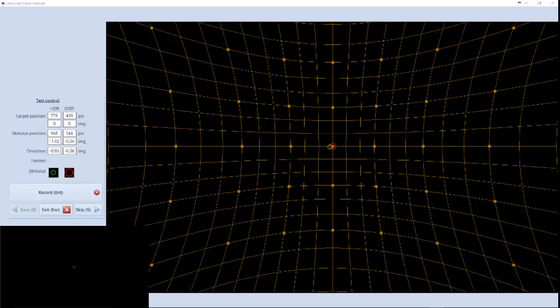As the eyes are dissociated, any deviation between the position of the larger and smaller circles is a direct measurement of the deviation in that direction of gaze. The test is repeated for each direction of gaze.